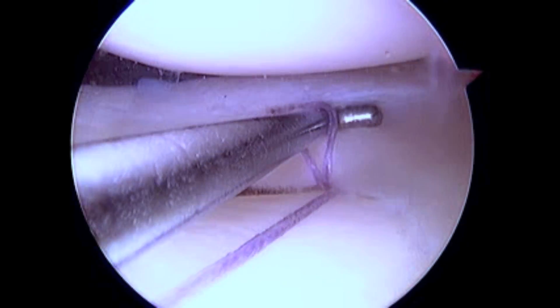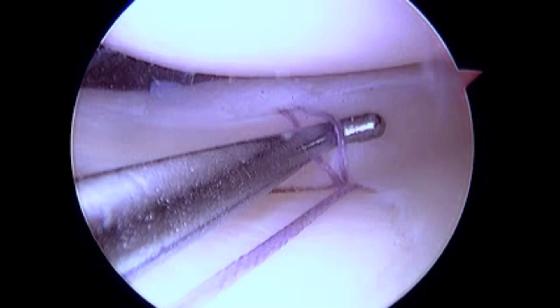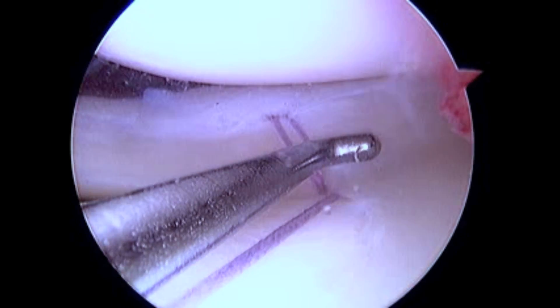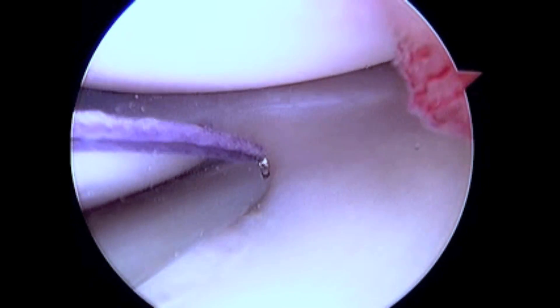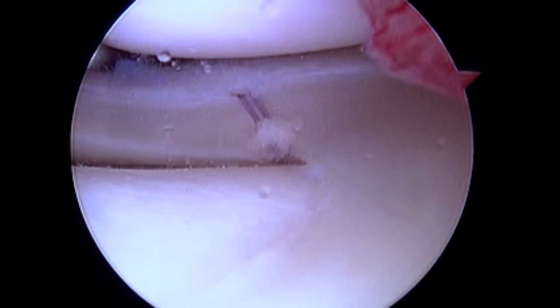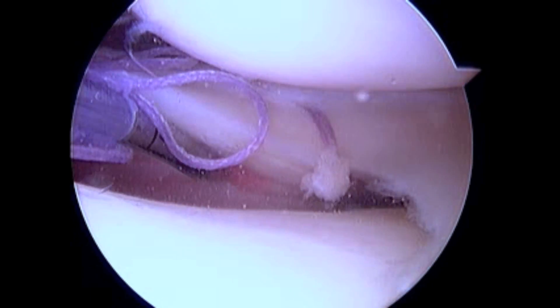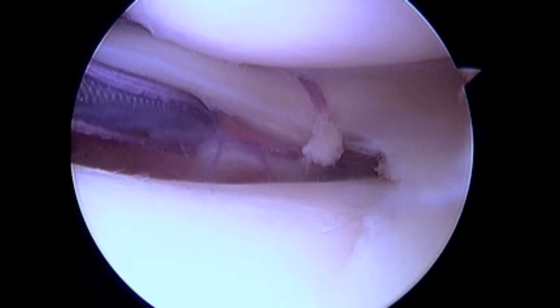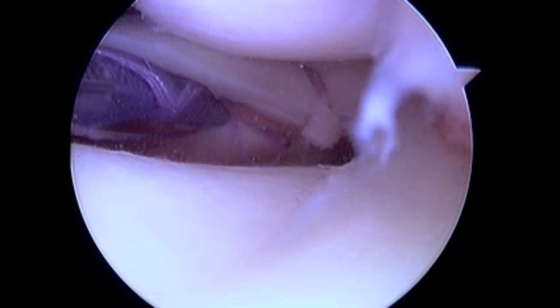You will notice that this is a knotless system, which I find highly advantageous to avoid wear and tear on the articular surface of the femur above and the tibia below. The tail of the suture is then cut flush to the meniscal surface. Due to the length of this longitudinal tear, a second vertical mattress suture is placed approximately one and a half centimeters medial to the first to complete our repair.